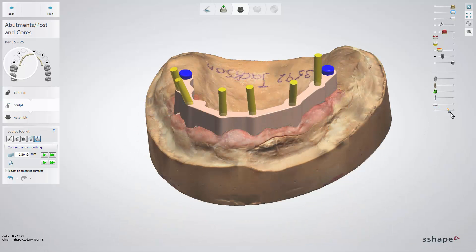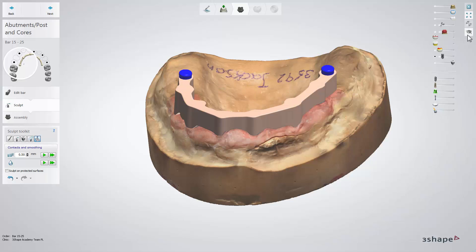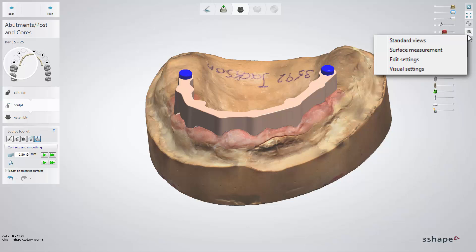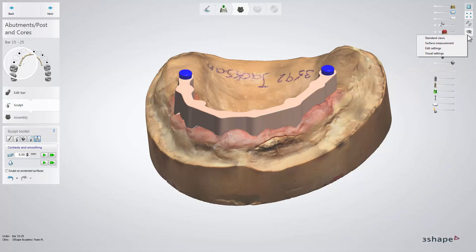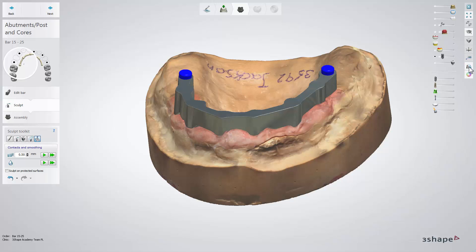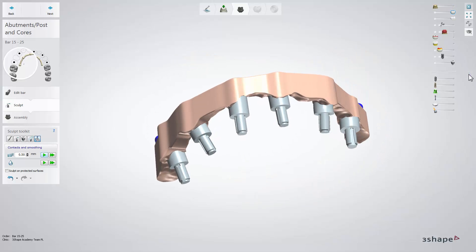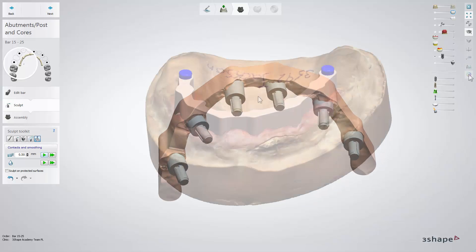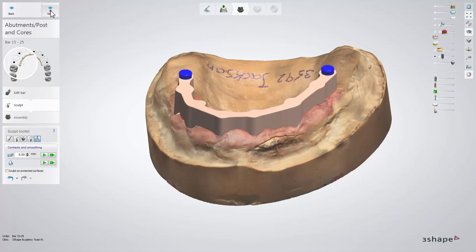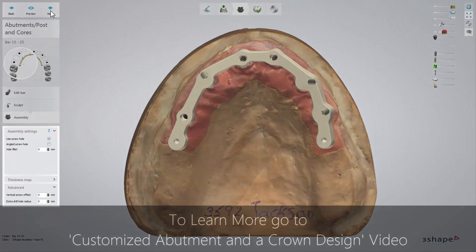Remember that you can always check the screw hole placement in your design and change the model view in visual settings. Once the modification of your design is finished, go to the assembly step by clicking next, where the bar and abutments will be combined. You can also modify the assembly settings here.